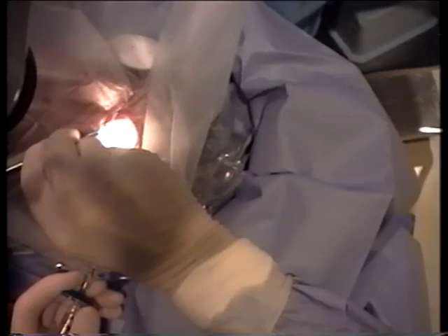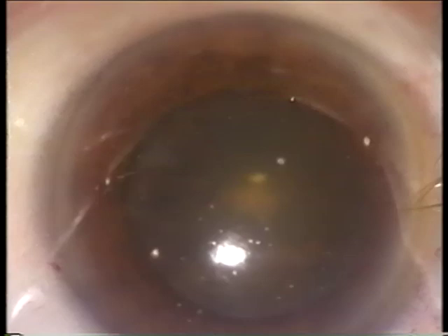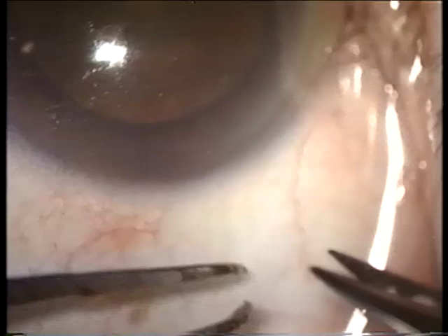The bright light there. And now look just a little bit to the right of it. That's good. The illumination on your light since you've done using topical anesthesia. Yes, certainly have. In fact, it's interesting when I do a case with a peribulbar now and the light has turned full brightness, it almost seems too bright for me because I've gotten used to the lower illumination.